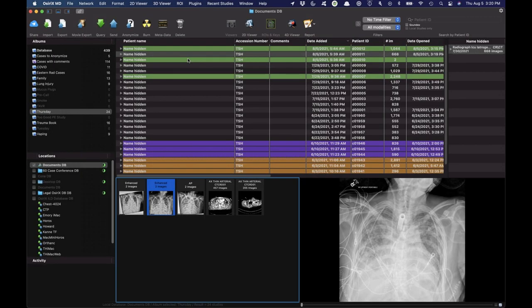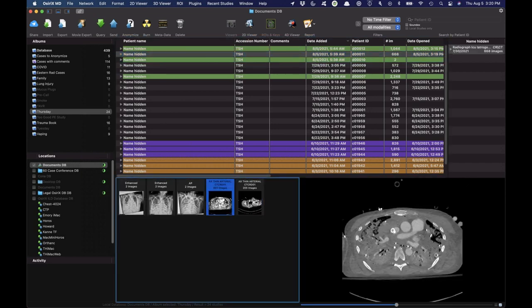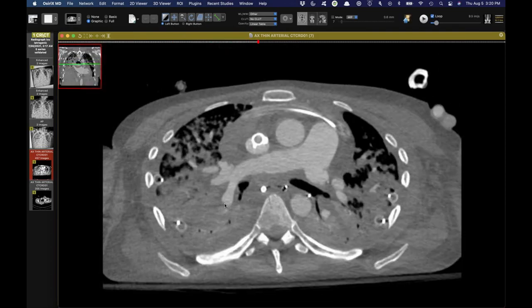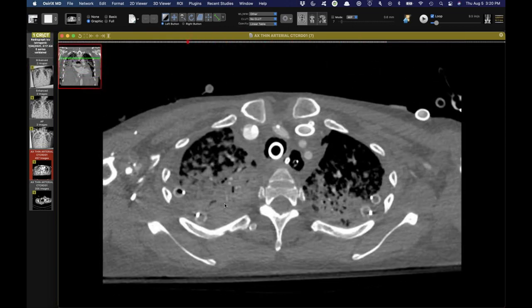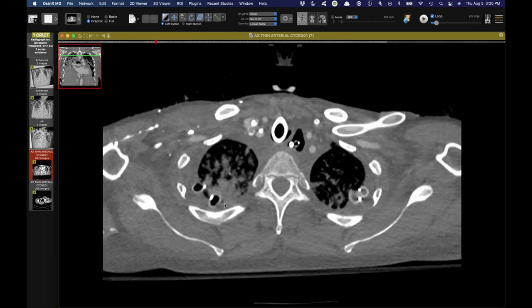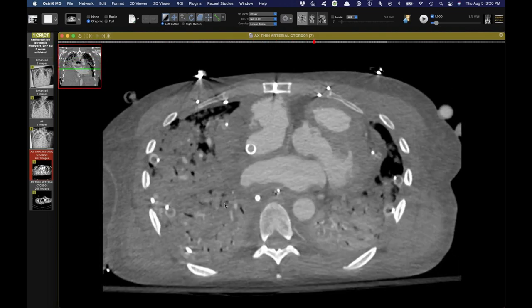Wow. Travis, is that a venous ECMO cannula, the big one? Yeah. I've not seen one placed via the subclavian. I believe it is, yeah. It's a very large caliber thing going via the subclavian, is it? Wow, it is. Yeah, you're right. Yeah. So probably a so-called dual channel venous ECMO.